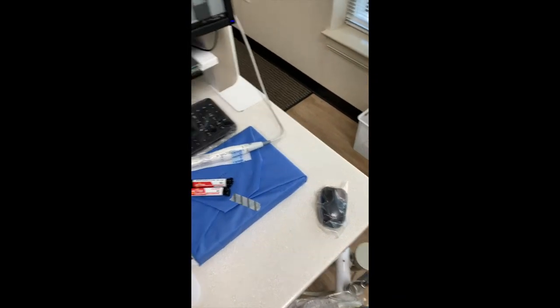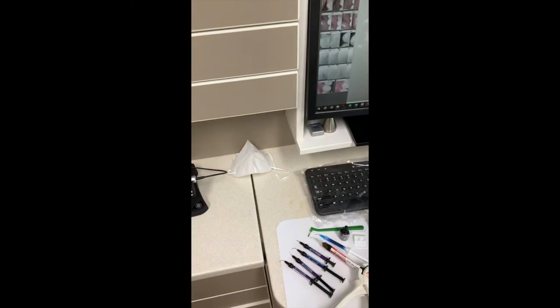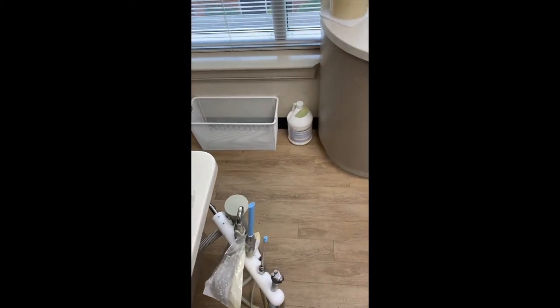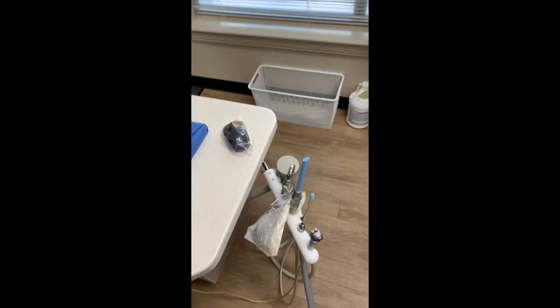You can see the mouse, the keyboard, and my N95 mask back there. We have extra suction devices — this is an Isolite or IsoDry — to help minimize dental aerosol.